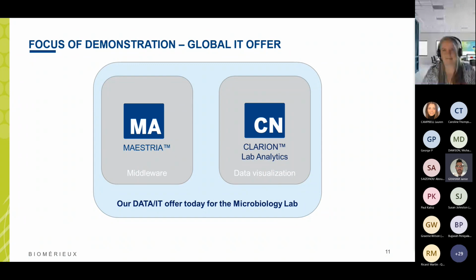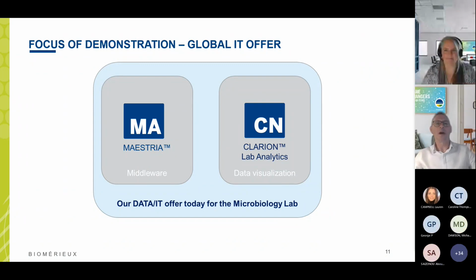So then, afternoon, everyone. So what can we do with that data? So the focus of my demonstration is going to be around MAESTRIA and CLARION Lab Analytics, which is our current data and IT offering for the micro lab.